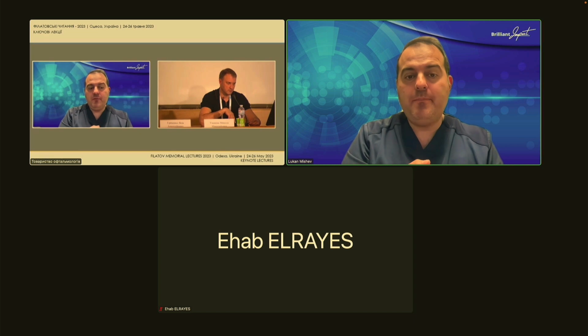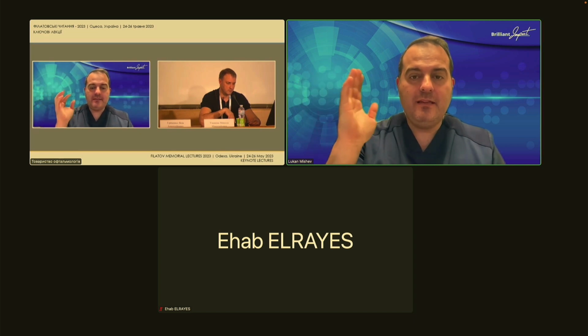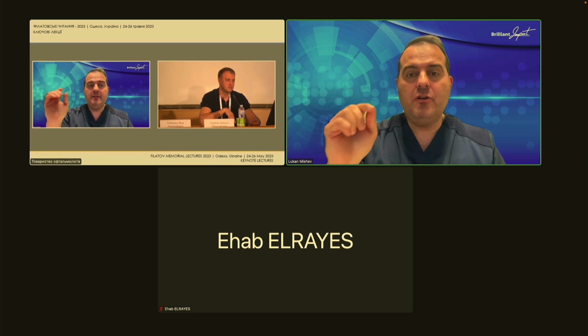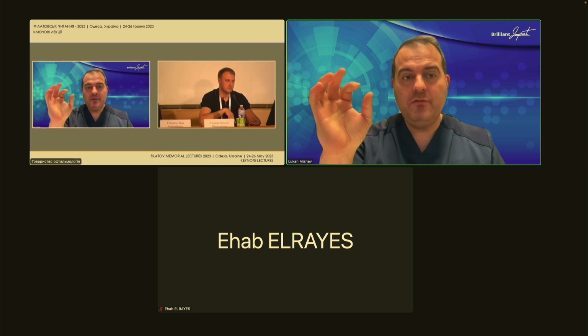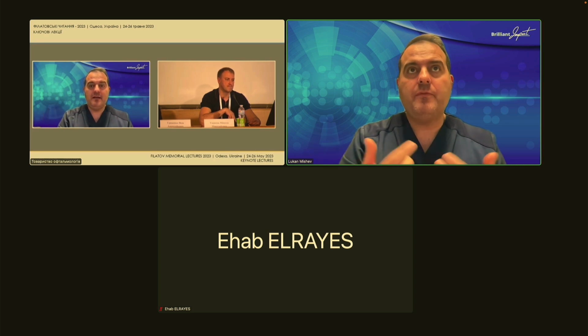Also, when you are playing with your slider, I would suggest starting at 30%. If you don't have enough light in the posterior segment, you might increase it to no more than 50. It is also related to the microscope you are using, for example the BIOM.